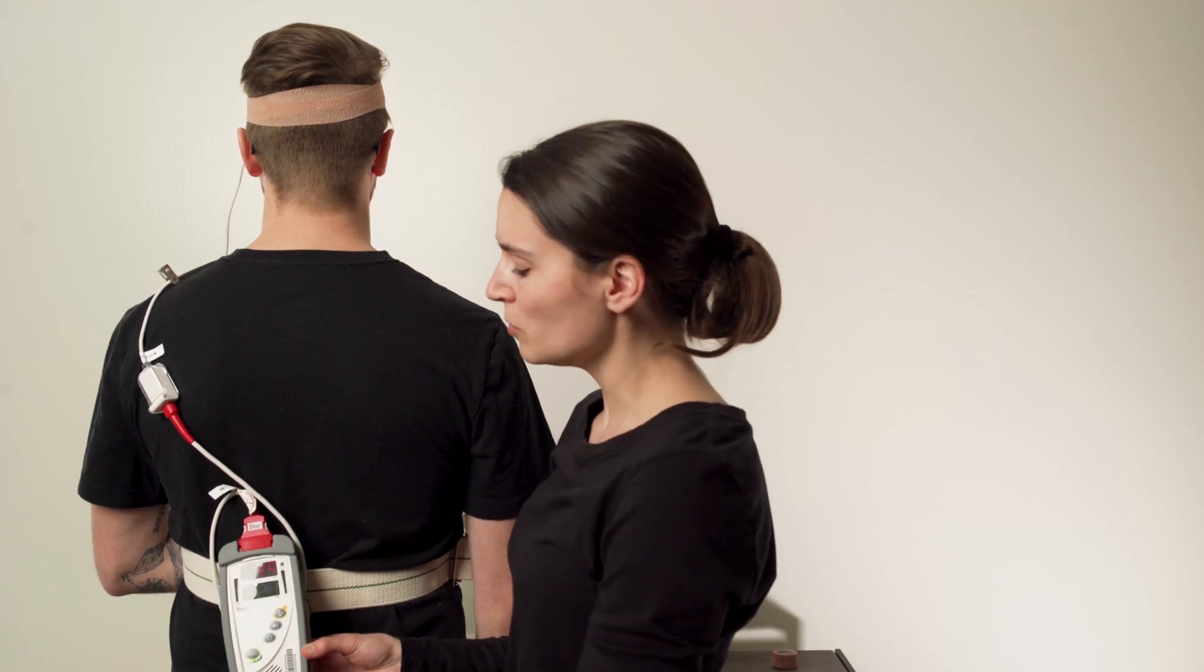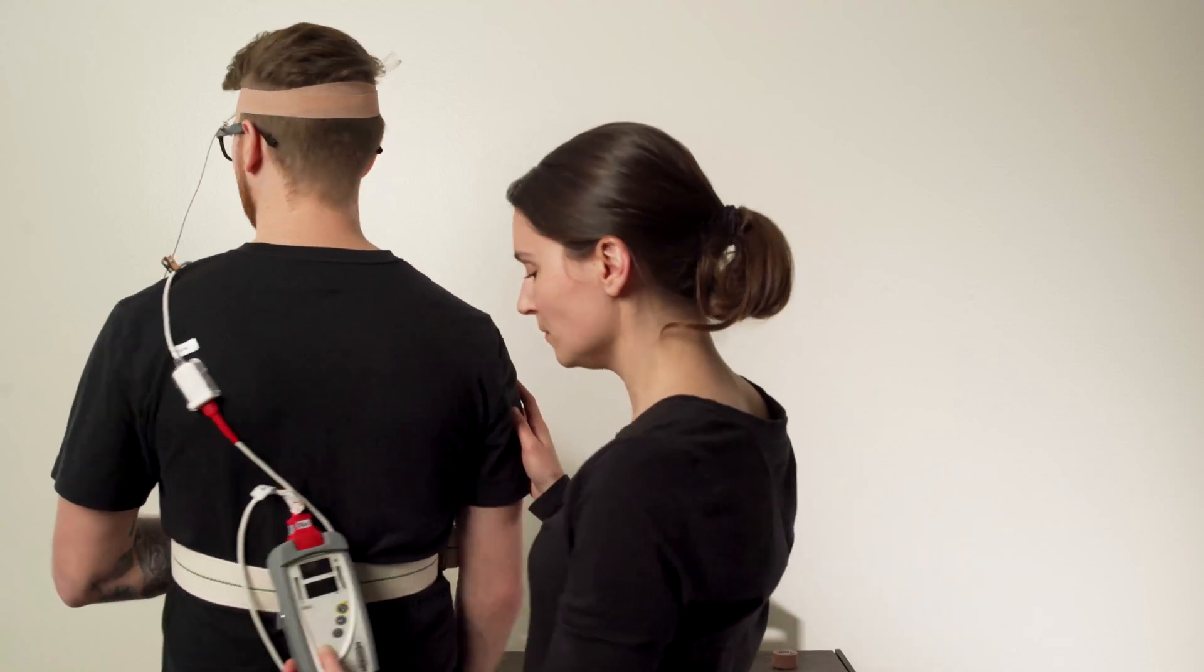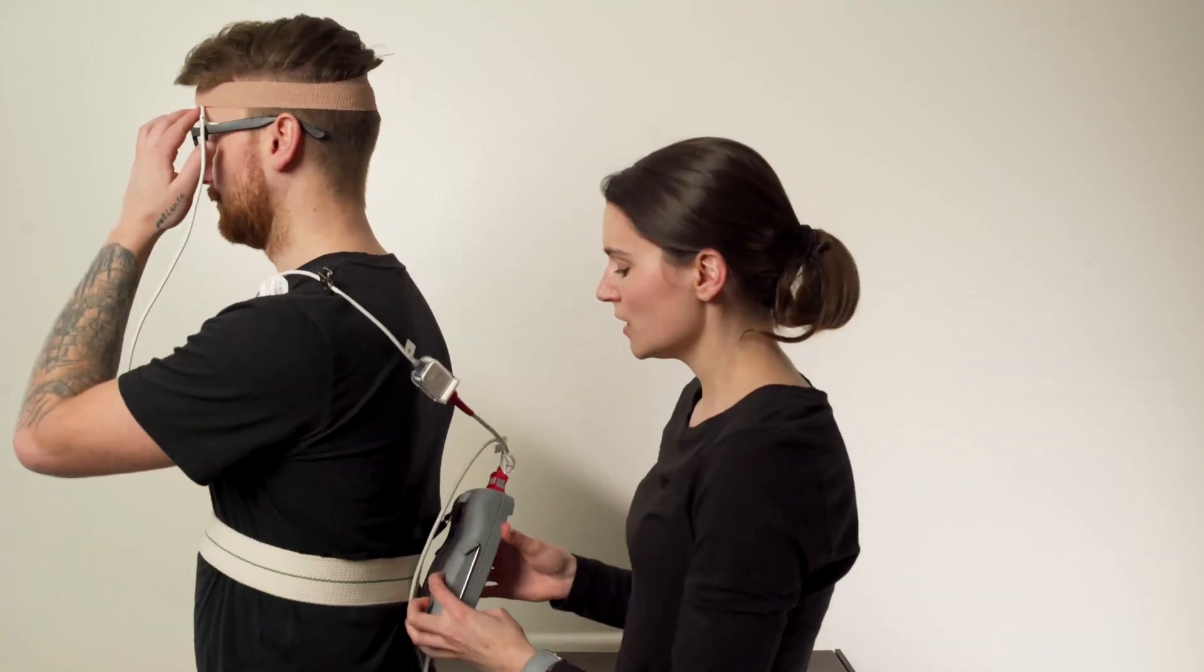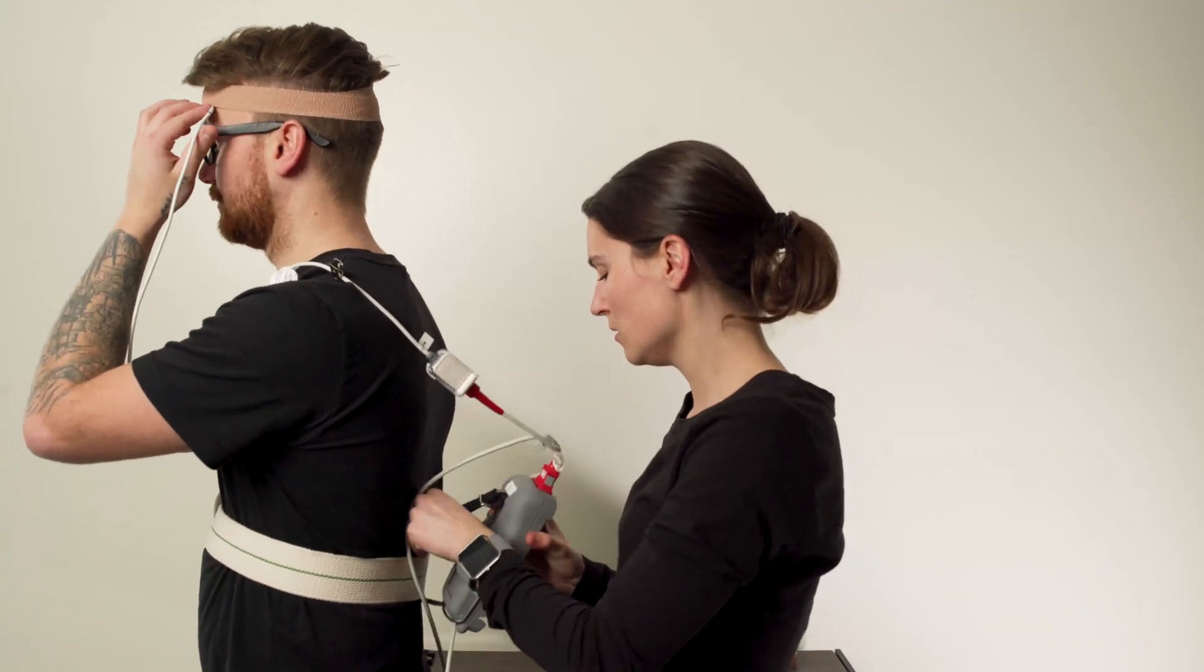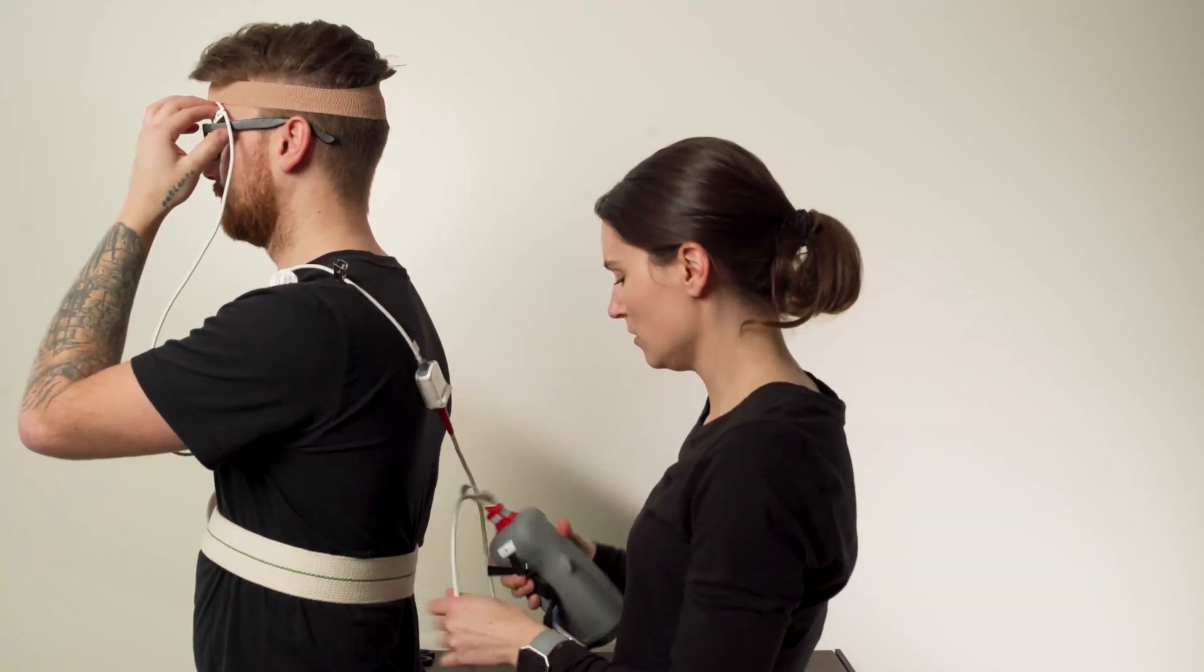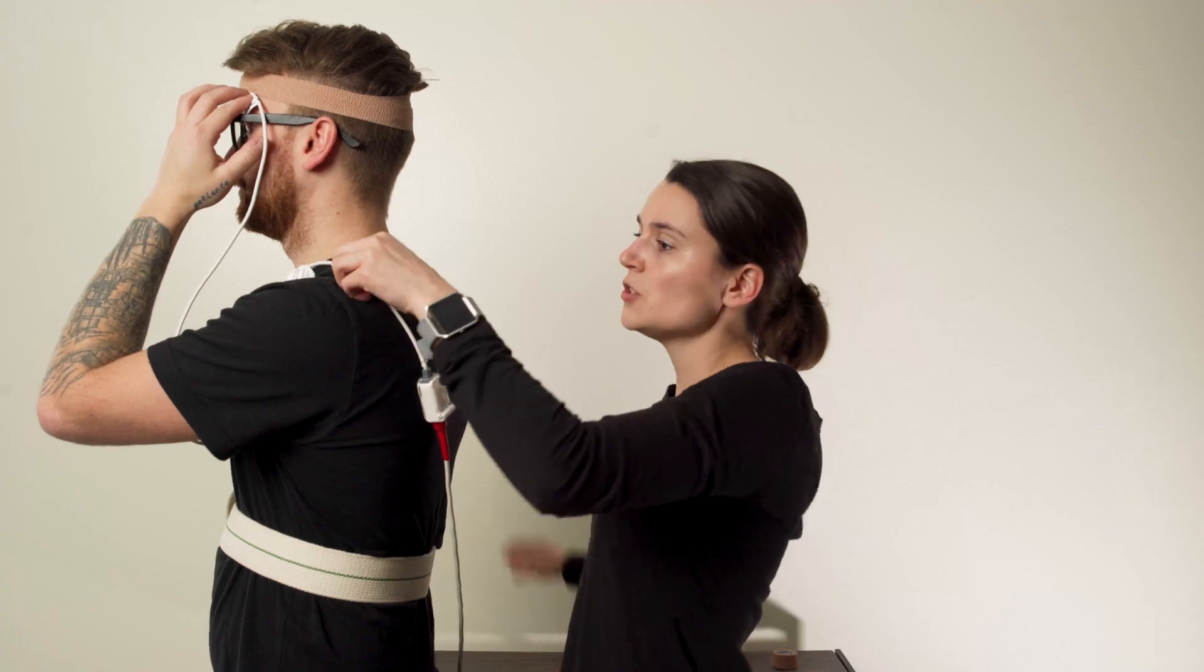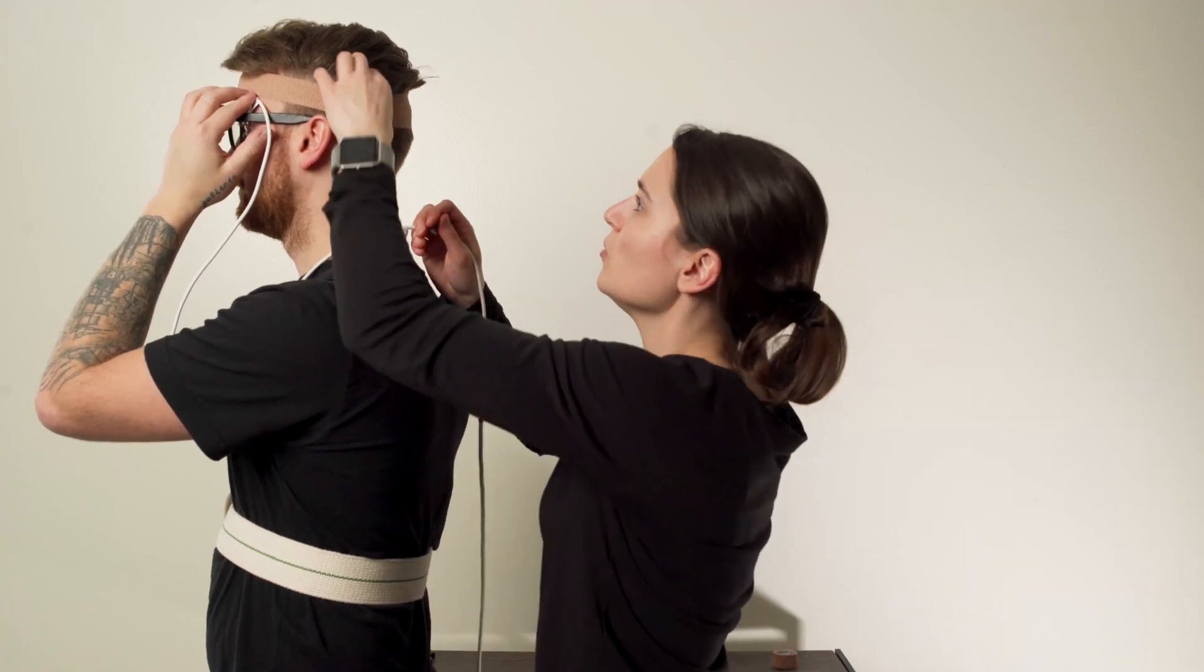Once you're done working with the patient, you'll remove the equipment. First, take it off the gait belt, undo the clip, and remove the Coban.